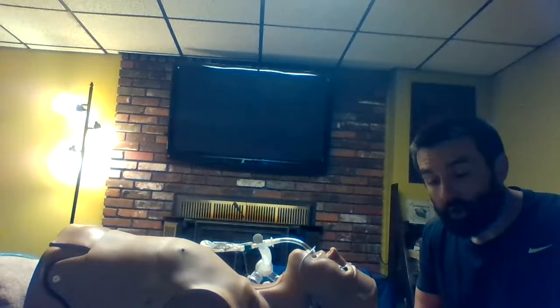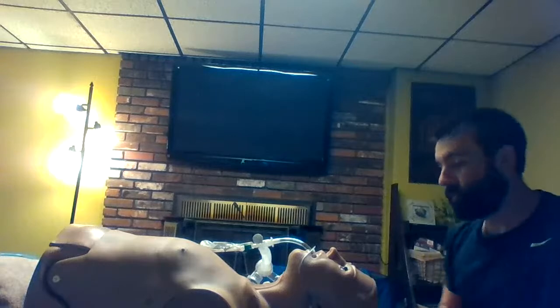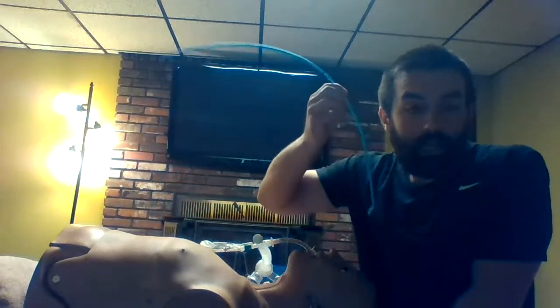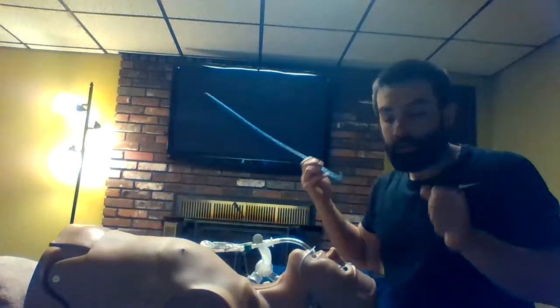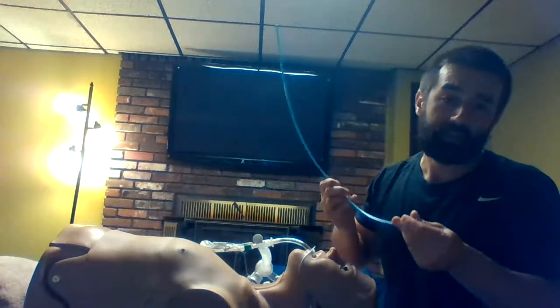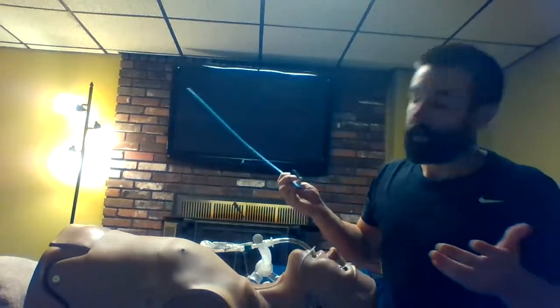We know that we're in the trachea here right now, okay? So what we could do, if we know we're in the trachea, instead of having to go through the process of completely re-intubating them, we can use a tube exchanger or a bougie, all right? We can lay this as a guide wire, pull the old ET tube out, put a new one down without actually having to, I mean, some doctors still scope them, but we know that we have something residing in the trachea, and we don't have to worry about having as much trouble getting that thing back in.